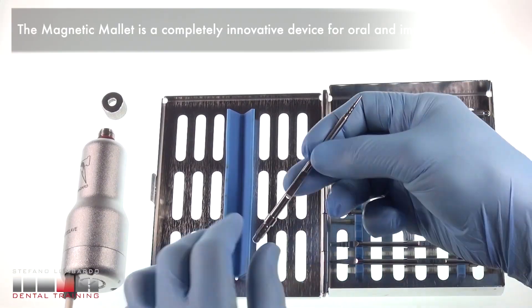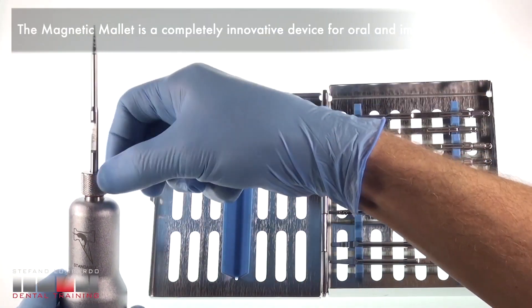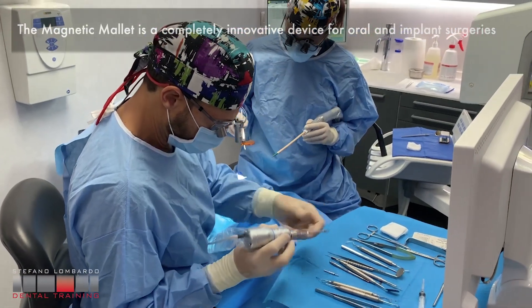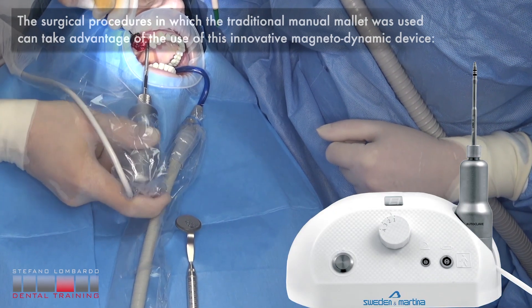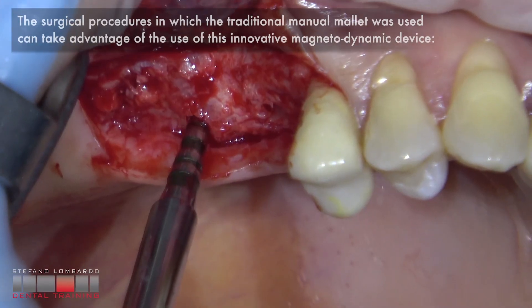The magnetic mallet is a completely innovative device for oral and implant surgeries. The surgical procedures in which the traditional manual mallet was used can take advantage of the use of this innovative magnetodynamic device.